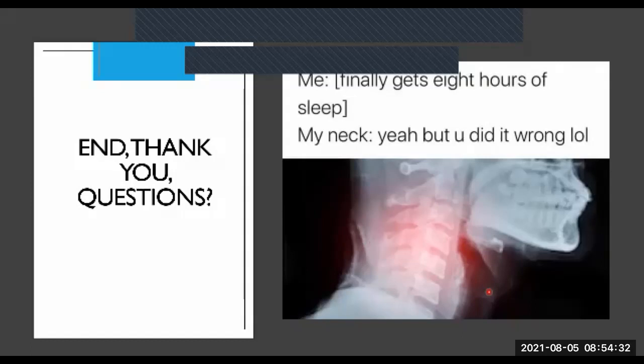Okay, so any questions? Anything I want to know? Not really. Completely understand the subject. Great. Okay. No, I'm just joking. What I'm saying, I know it's not exhaustive, but it's just to give you an idea of the normal, so that when you see the abnormal, you get the hang of it, right?